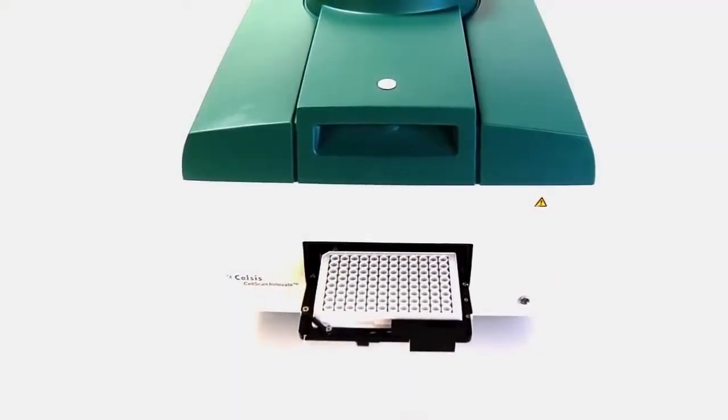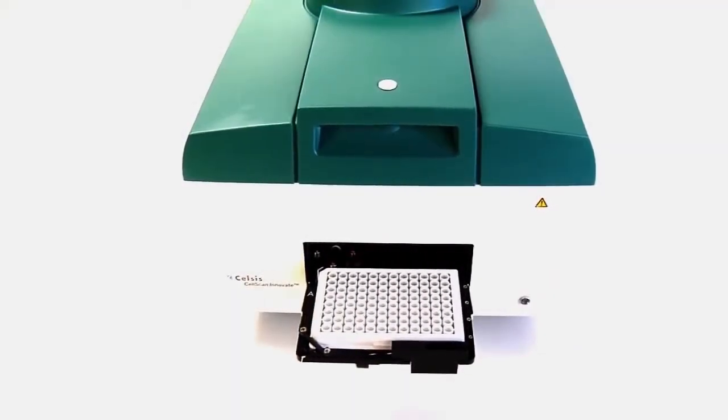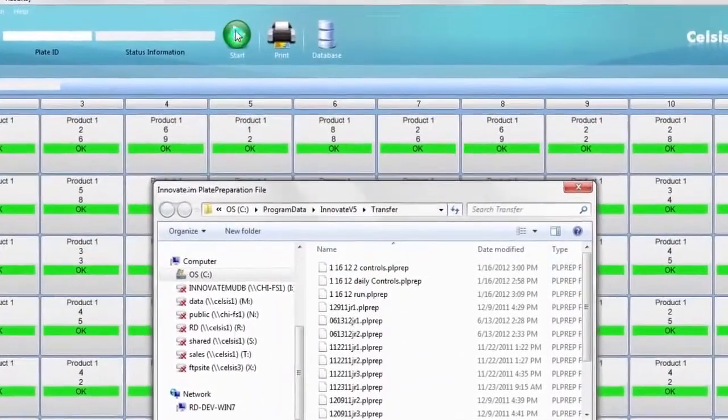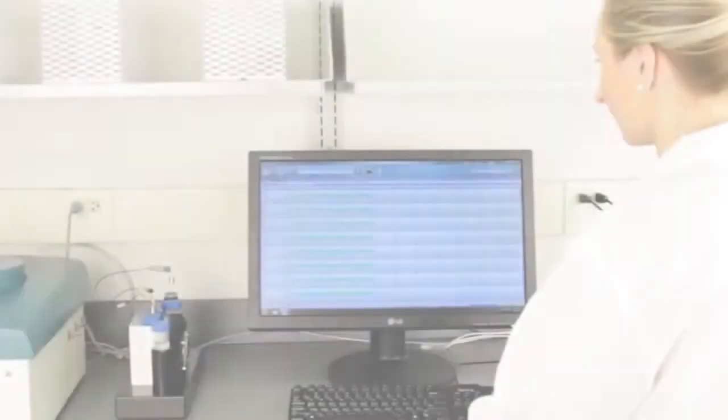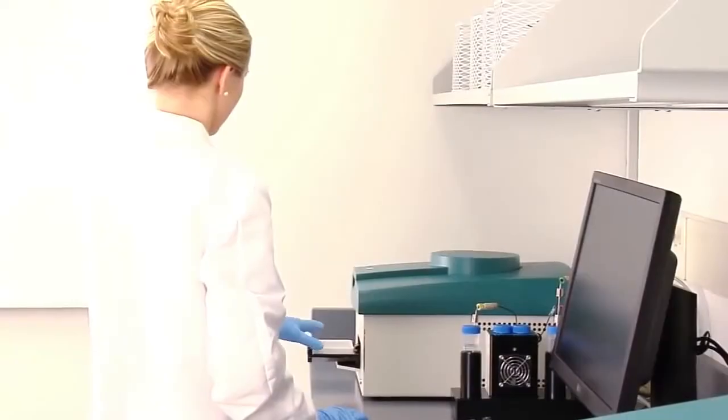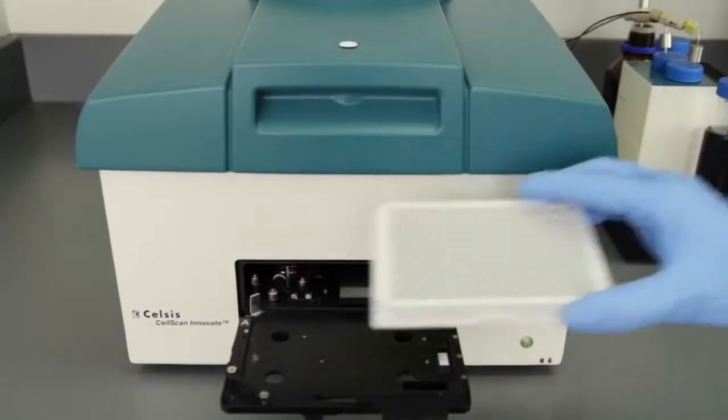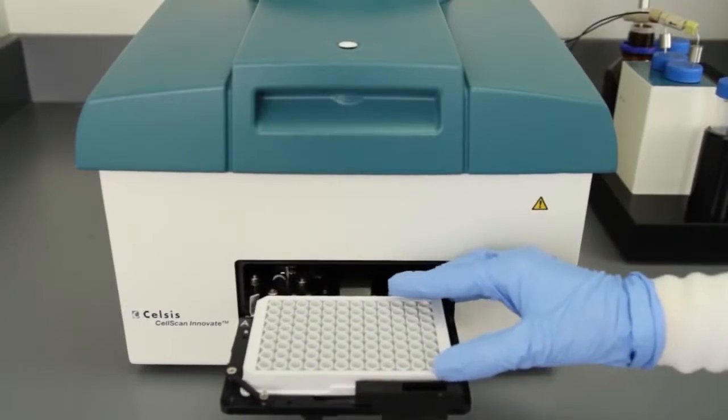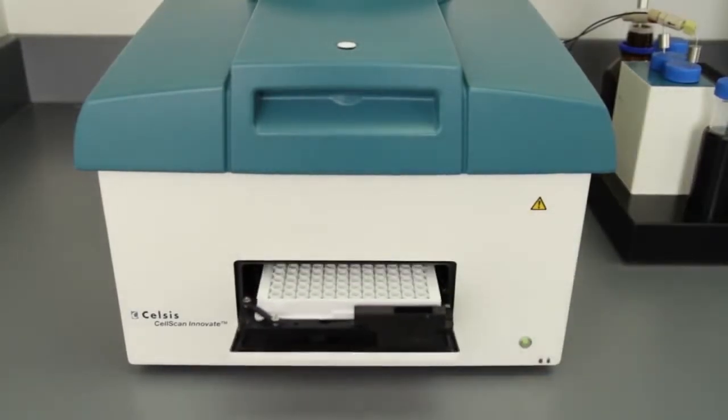And the Celsis Innovate system is ready for more. Return to the main screen and click Start. Identify and select the plate you recorded and saved earlier, or enter a new one. The Innovate will automatically unload the previous plate, allowing you to use any remaining wells of that plate, or to load a new one.